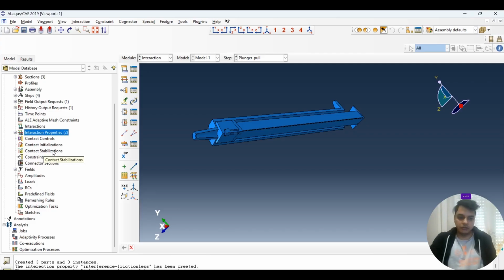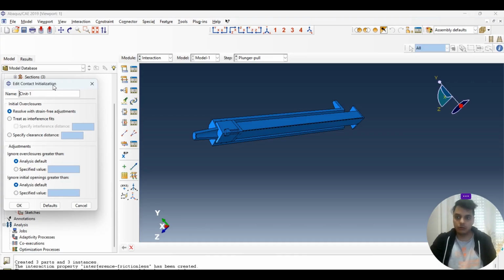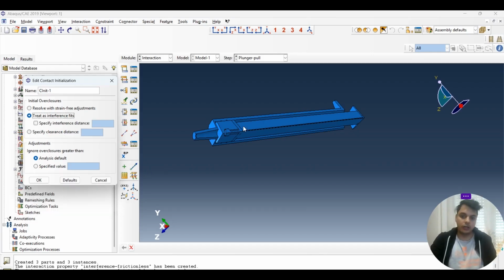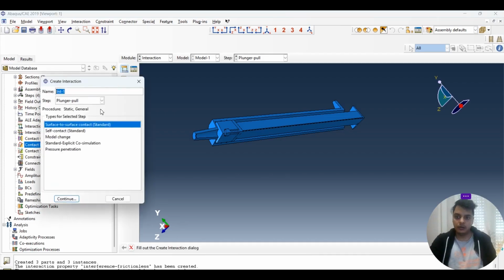So we also want the initialization, so that the software should know we have initial interference that has to be ignored. So we have to ignore it rather than treat it as an interference fit. So it's good enough. Right now we have defined the properties, we have to assign them. So simply just put it here.